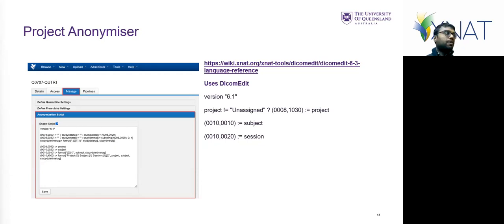We can add QUT_RT as an alias into your project, which will send future data into the right spot, but minimizing the number of aliases is probably best for the platform. Data doesn't disappear down a black hole. We have a mechanism to get it onto XNAT as soon as possible, but we can't let the pre-archive fill up because it's not on secured long-term data storage.